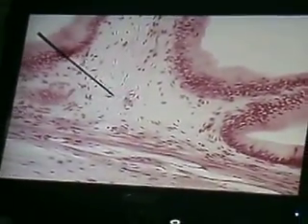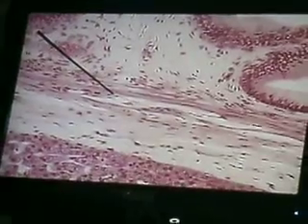So this one is your lamina propria. What is this layer? Fibromuscular coat or layer. What are the two components of your fibromuscular coat? And that's the fiber. And this one, this is the layer. Fibromuscular coat or layer. This is composed of connective tissue.